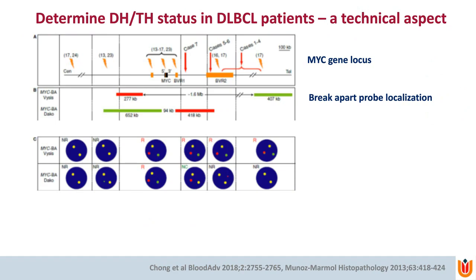Probe localization, and a technical aspect. When I first showed you how we choose the probes on either side of the breakpoint, that sounds quite easy. And in the top panel, you see the MYC gene. MYC is that little black dot in the middle. It's a small gene.